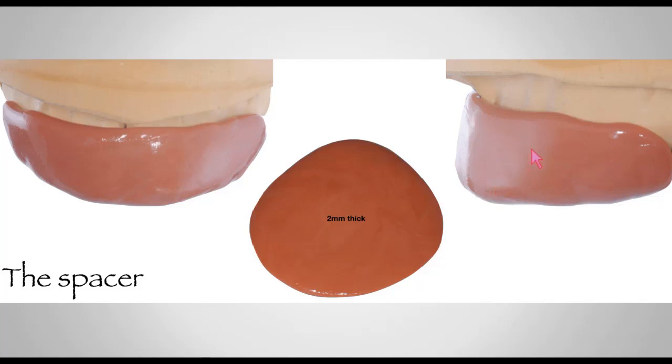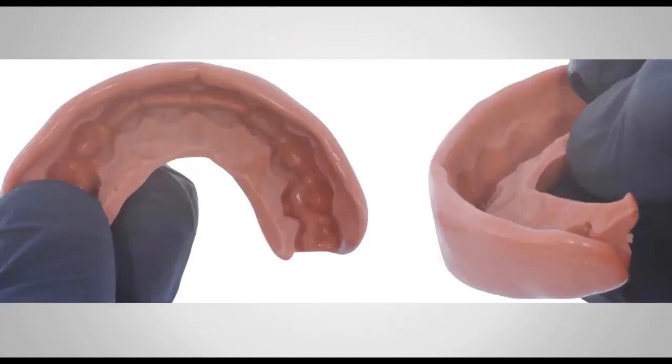The other thing that I want you to visualize is that it is very nice and smooth. So I take my time before this putty matrix polymerizes to smooth it out very nicely with my fingers. And this is crucial because of the next step. Here you can see how nice and smooth it is once it's polymerized. You can see how thin it is on the facial, how thin it is on the lingual, and how thin it is on the incisal. You can actually see a little bit of light going through the incisal edge, so it's probably a millimeter in this area.